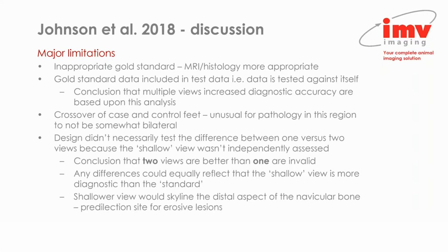The gold standard data was also included in the test data. So essentially the authors were testing the data against itself, which should not happen in a scientific study. And so making any conclusions that multiple views or 2 views increase the diagnostic accuracy of radiography based upon this analysis is inappropriate and pretty weak.